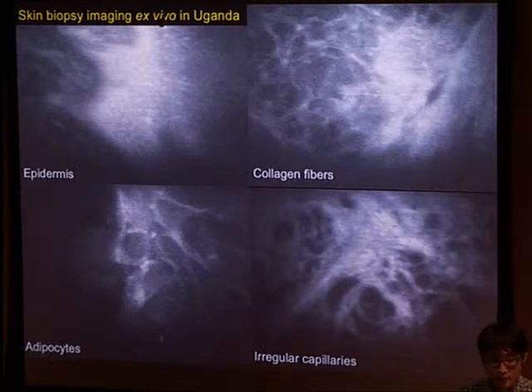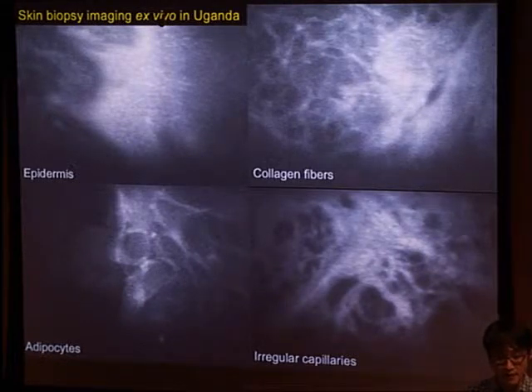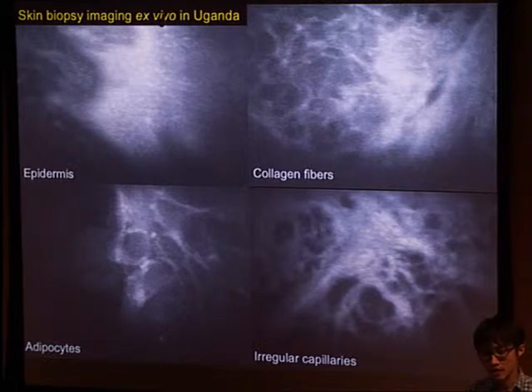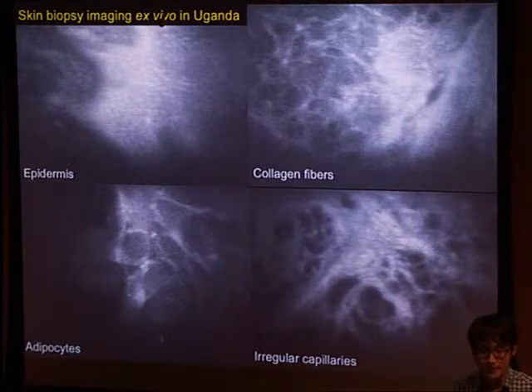So that's a little bit of a challenge for some of the diseases. But many of the skin diseases actually arise from the epidermis area, so being able to take a look at the boundary between epidermis and dermis is important. And this might be able to do it for certain cases. Why didn't you choose a longer wavelength but still one that can be detected by the cell phone?